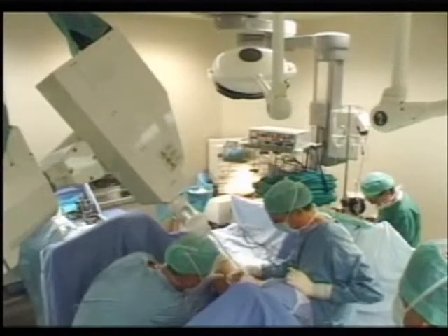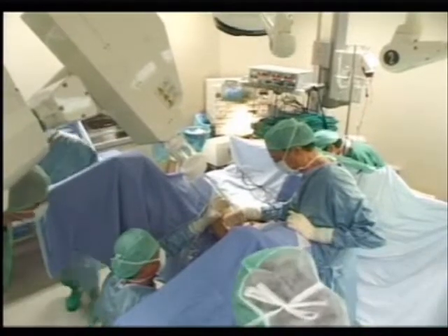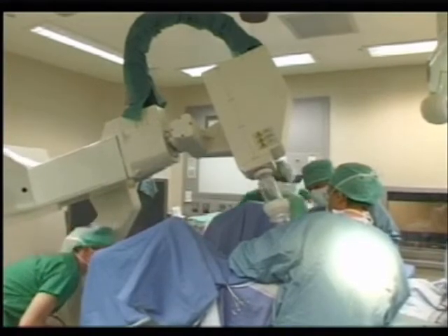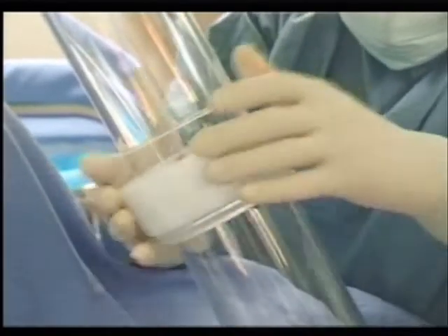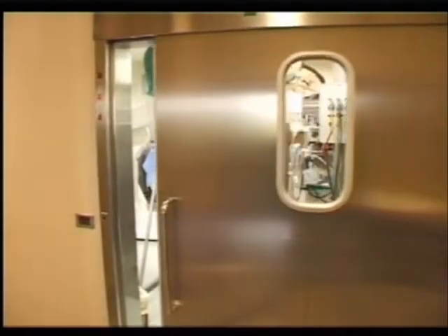About 4 years ago, Novac 7, a dedicated mobile accelerator made by Hitesys in cooperation with Enea, generating electrons, was installed at the Istituto Europeo di Oncologia, based in Milan. Novac 7 was designed only for ELIOT treatments. It has special characteristics and is light and small-sized. It can be sterilized and produces low environmental radiation, and for these reasons it can be used in the operating room without any special shielded facilities for radiation protection.